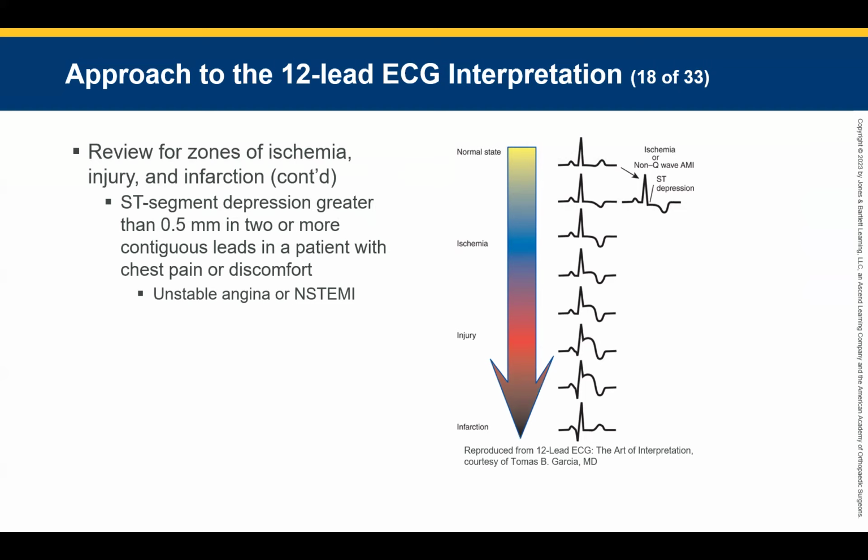Everybody agree? As we get ischemic, we'll start to see that T wave flip sometimes. That's often an early sign of a problem. And then we slowly go from ischemia, lack of oxygen, to injury, infarct. So we go into the injury portion, we start to see that J point rise. You guys see this J point rising? A little bit off baseline, more off baseline, more off baseline. Now that J point's way up there. Once that tissue's dead, and everything's over, we typically will lose all that ST segment elevation. We start to get this bigger Q wave. You guys see how Q waves develop over time?